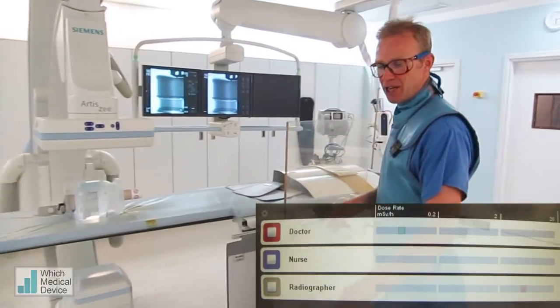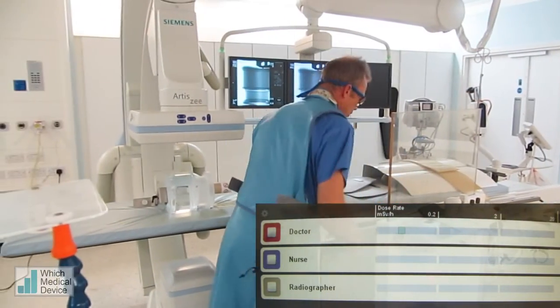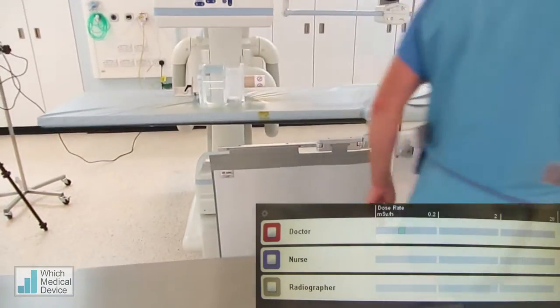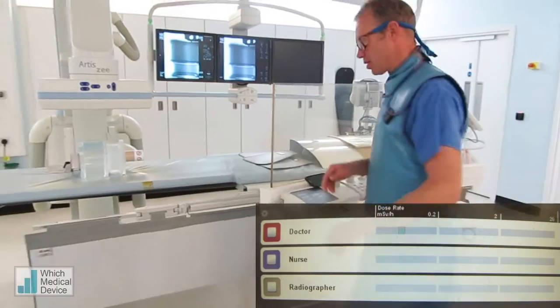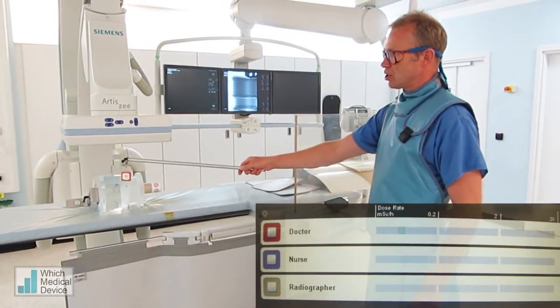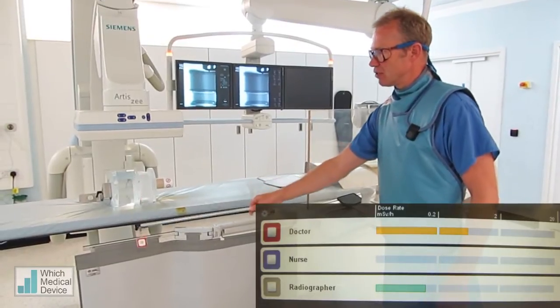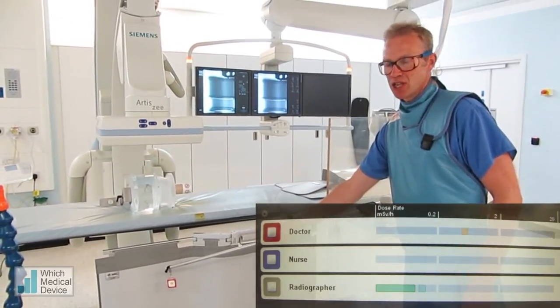We're just going to repeat that now, bringing some of these lead screens in. A very important one, and it's one I always use, is a lead screen in front of your legs. And you can see when we're screening now and we hold the dose metre near the patient, we're going to bring it down. Not surprisingly, when we get down behind the lead, that dose is virtually zero.